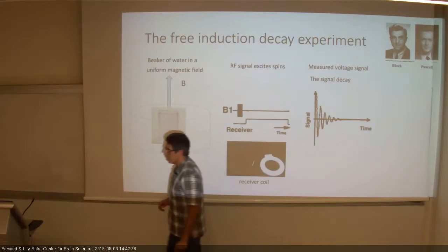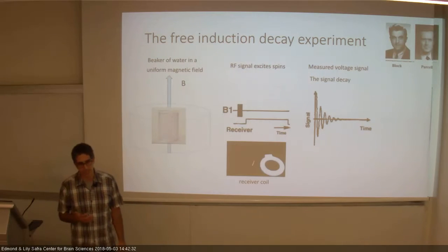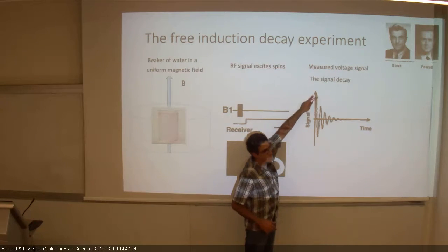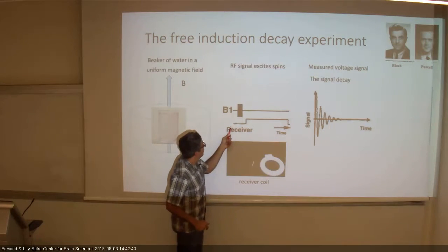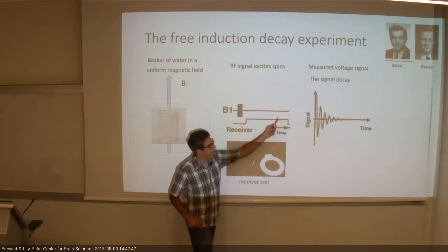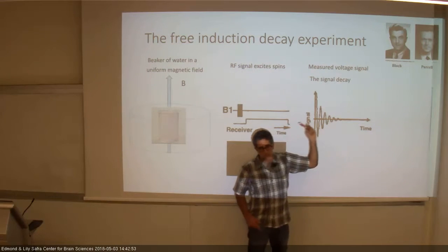Fine. So what was happening here? We just mentioned it. That's relaxing, right? The system relaxed. So if there were no relaxation, that's how I showed you before in the movie, it was just going up and down, up and down, up and down. But since they use excitation and then open the receiver afterward, and they wait and wait and wait, that's what it looks like. The thing will keep oscillating, but until they get to their noise level and they cannot measure anymore. The signal is gone.